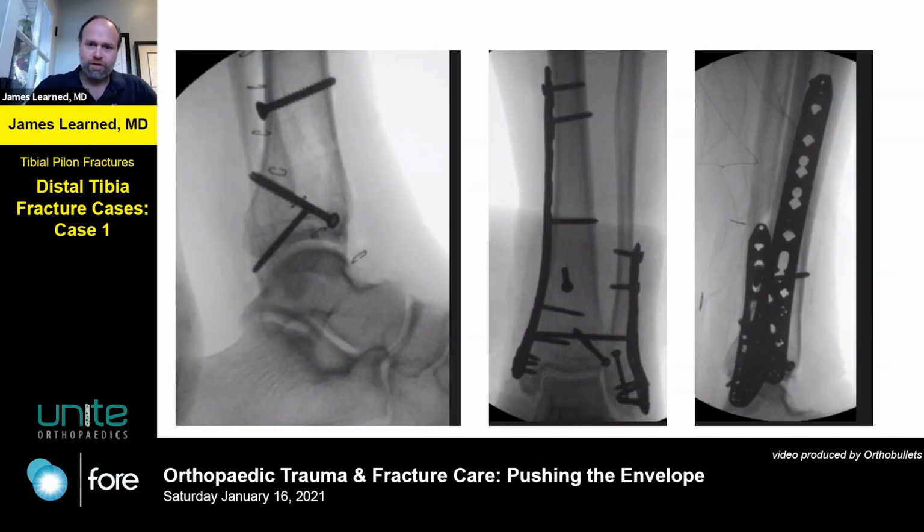So intraoperatively, the way this one was treated is some open reduction and independent lag screw fixation. And anytime you've got a fracture surface that you can compress, I know that Dr. Marichek is a big fan of compression of any fracture surface. So this is sort of letting lag screws be lag screws and let them do their thing. So we've got an anatomic reduction up here at the cranial spike on the lateral view. And we've got that lag screw going from that displaced posterior spike into the anterior tibial cortex that's intact. So that's acting at the apex of that fracture.